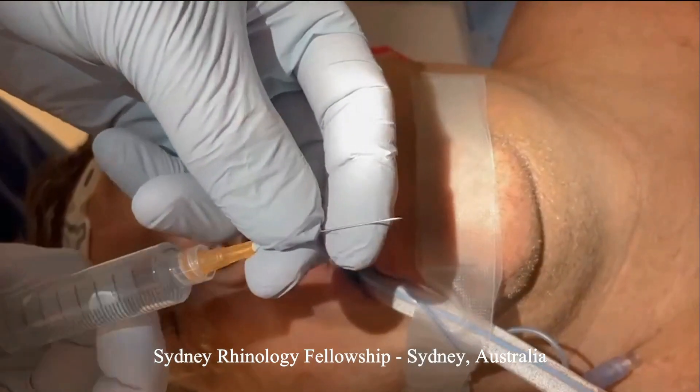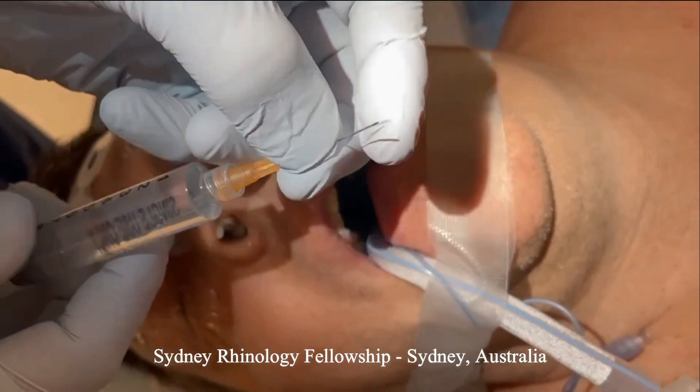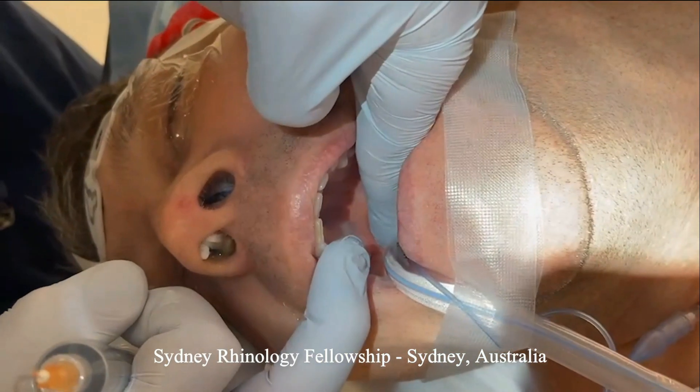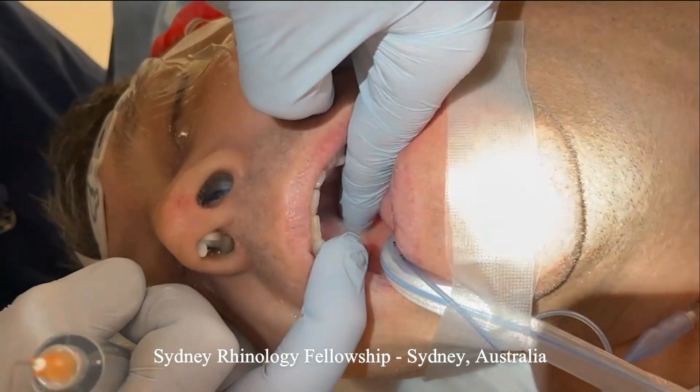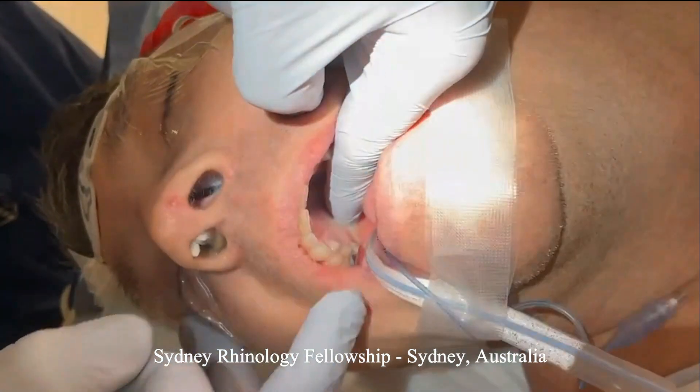The injection starts by bending a 1.5 inch 25 gauge needle at 25mm for an adult, 20mm for people aged 6 to 18, and for those under 6 years of age, 12mm.